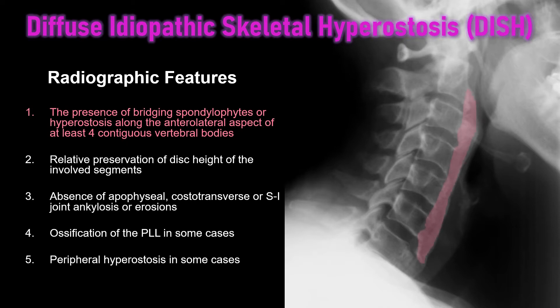The key radiographic feature of DISH is flowing hyperostosis, or bridging spondylophyte formation, in three or more contiguous segments. This is best seen in the highlighted region anterior to the cervical spine, and again this is continuous flowing hyperostosis — a key feature of DISH.